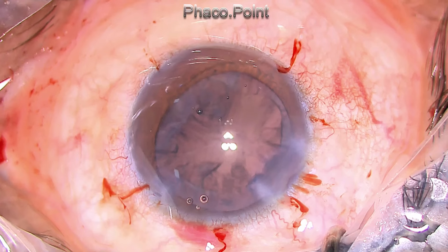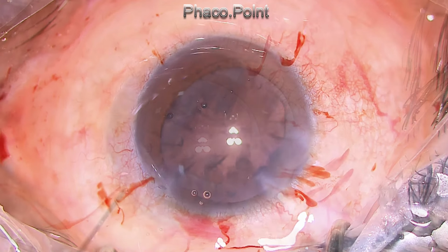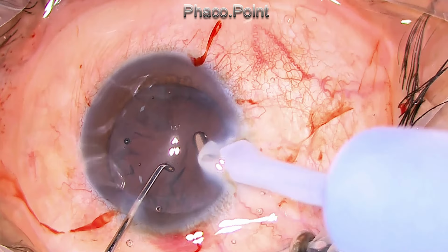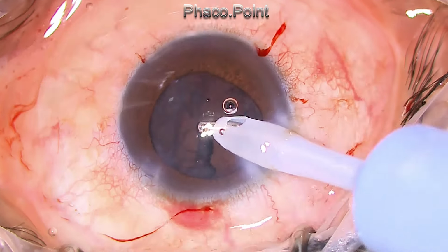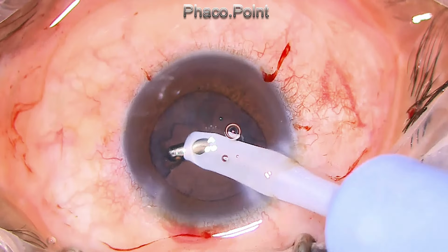Since the bag is well centered with the CTR and there's no listing or tilting of the bag, it just indicates that the CTR was enough to support this zonular weakness. The patient was a high myope. He didn't have any syndromes like Marfan's or homocystinuria that I could work out, and still there was a zonular weakness. I think zonular weakness can exist in patients with high myopia.